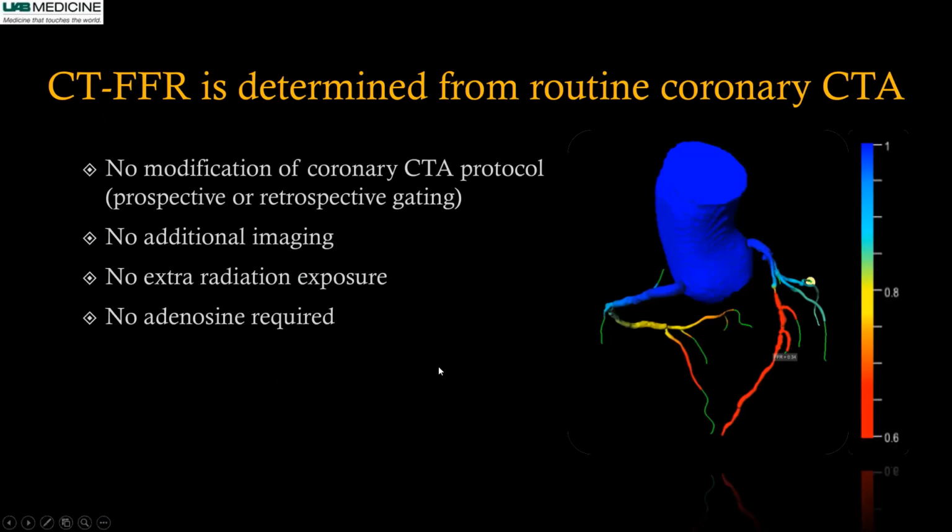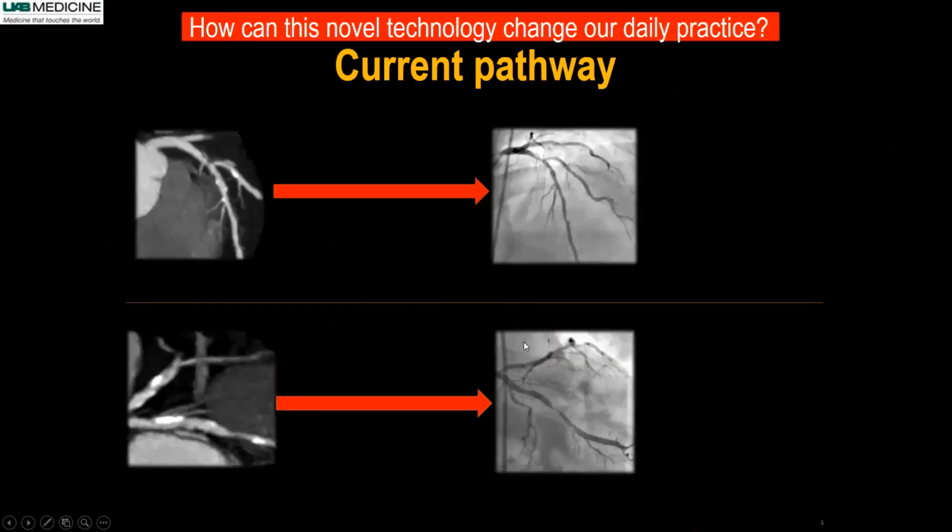I think it should be available at a cheaper rate and probably should be done on the spot within the department itself with a good turnaround time. These images which I am showing you are from Dr. Robert Campbell, who is the CMO of the HeartFlow company.